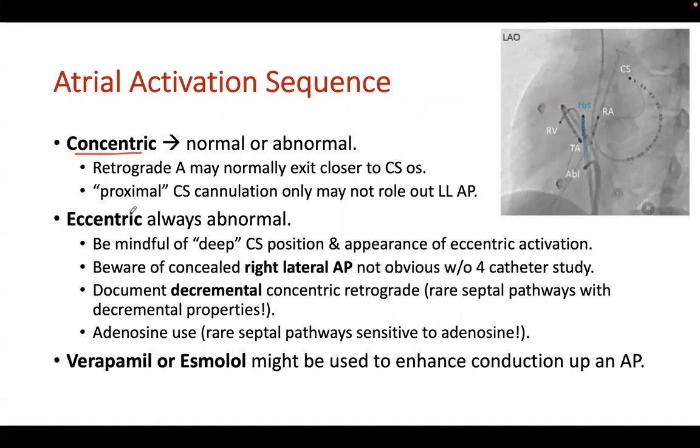Like in this example, this is a very deeply located CS. If you see, however, eccentric atrial activation or abnormal looking atrial activation, this is then always abnormal. But you have to be mindful.